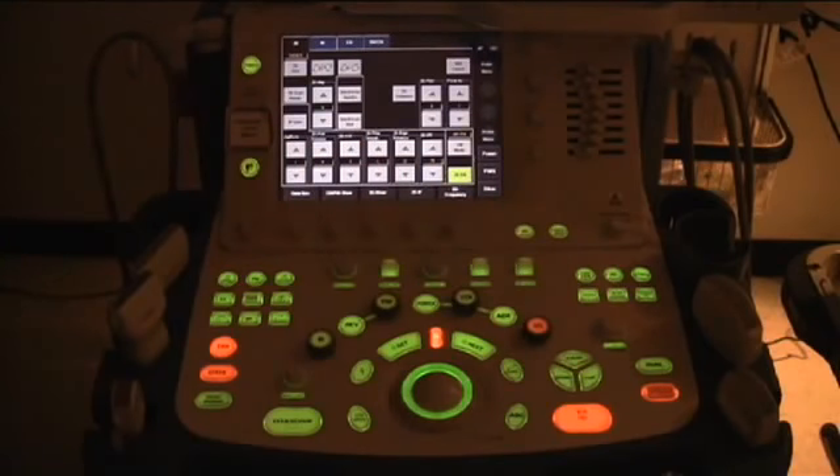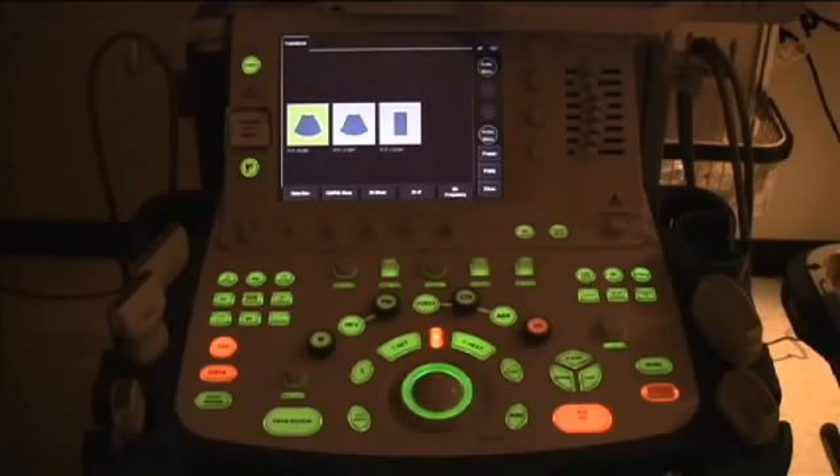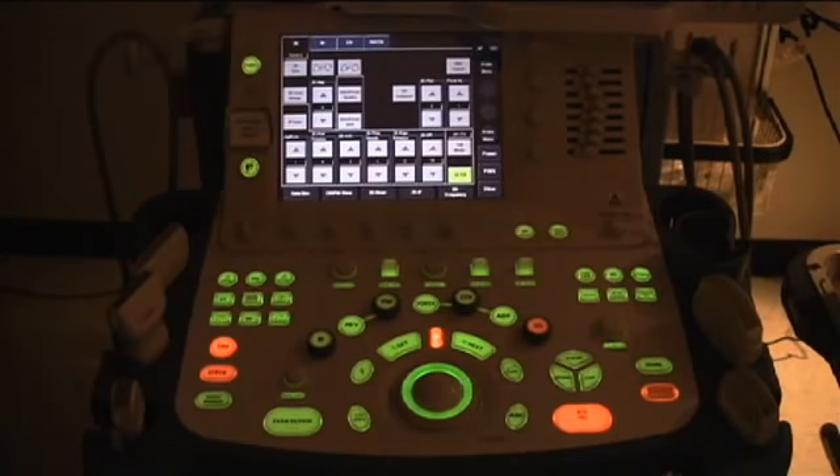To select the transducer in one of the top three slots, press Probe Menu on the touch panel. For the abdominal phantom, press the curved 382BT probe. The curved small probe is now active.